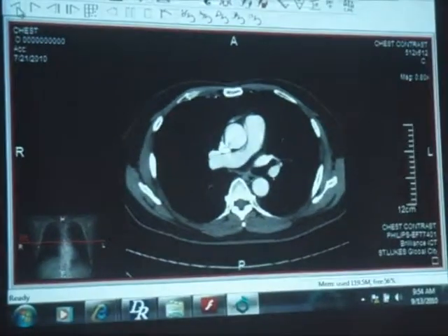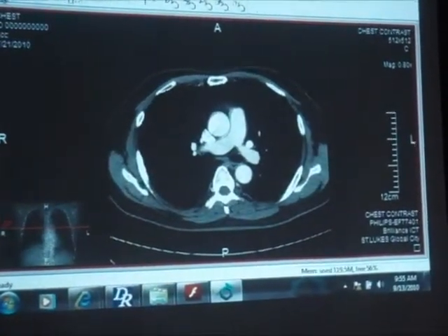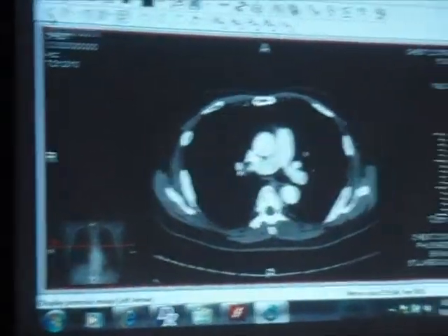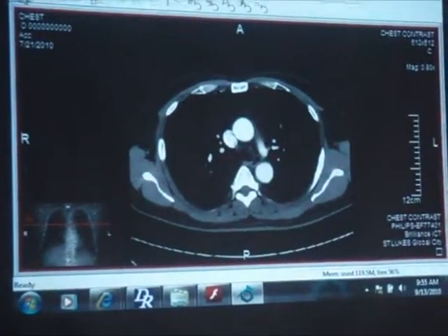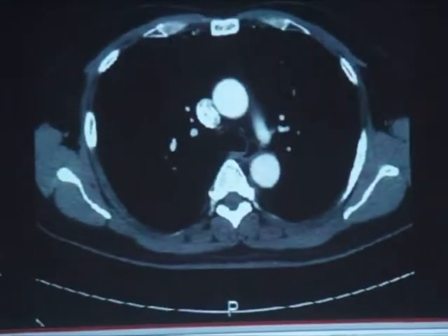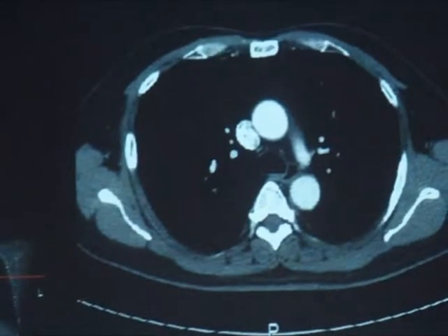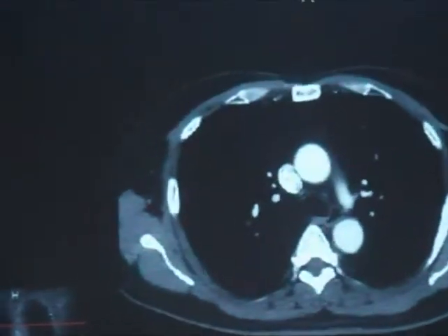Pulmonary artery. So that's a pulmonary artery. It divides into right and left. Okay, so the chambers of the heart, the main arteries we've already discussed. And then the major branches of the aortic arch, the three vessels. We talked about the superior vena cava, and we talked about the right atrium where it drains to.